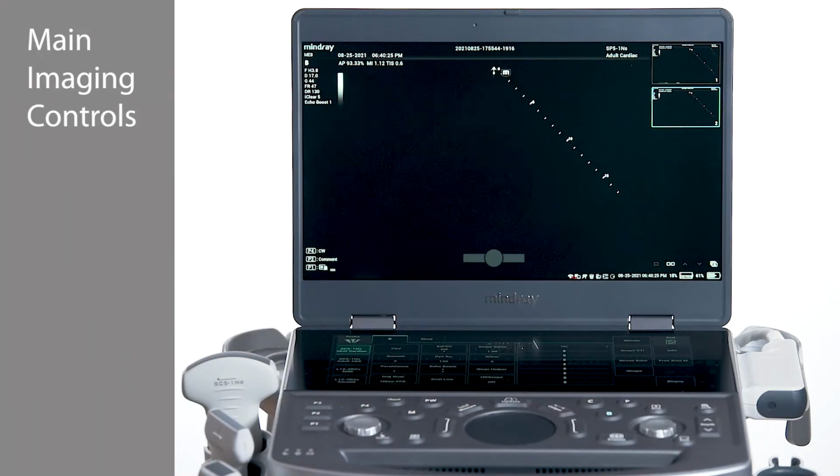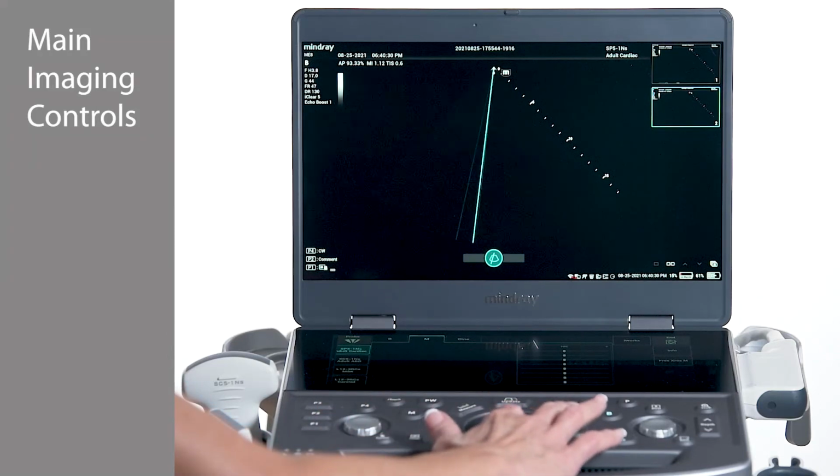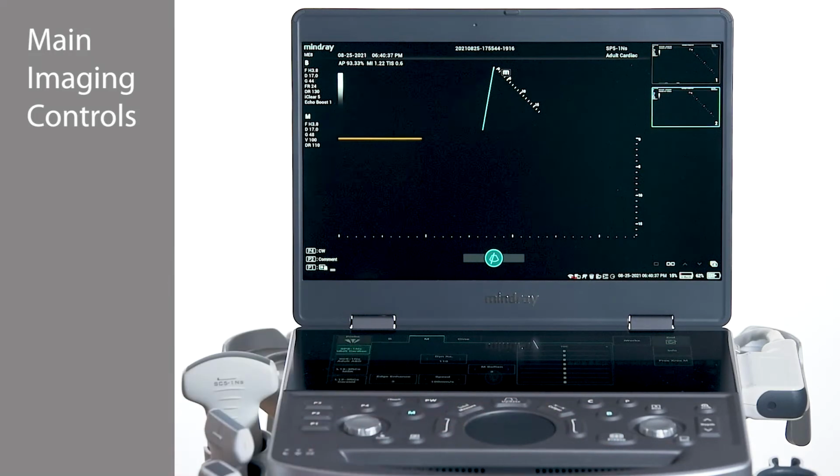To access M mode, press the M key on the left side of the keypad and position the sample line on your image by using the trackpad. To initiate, press the M key a second time or press the Update key.